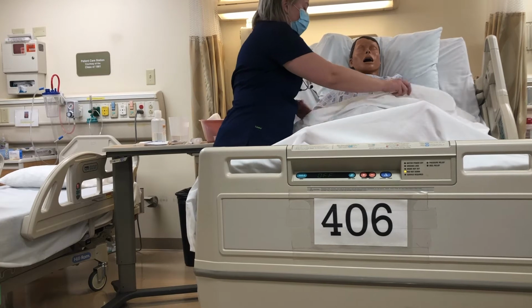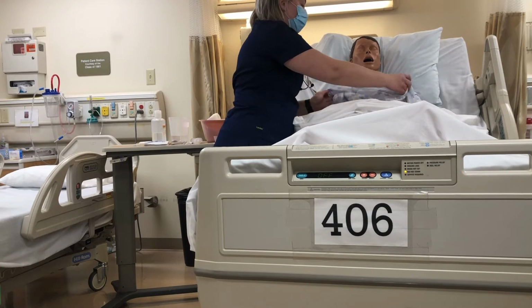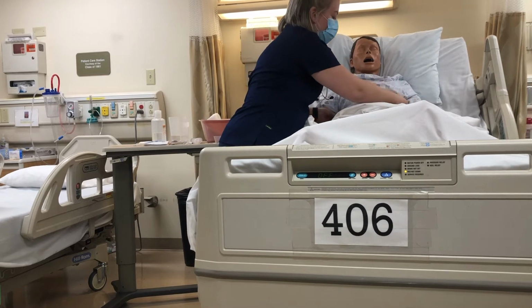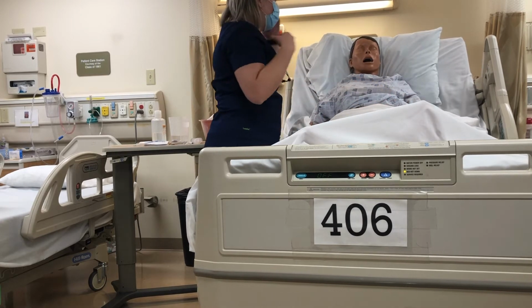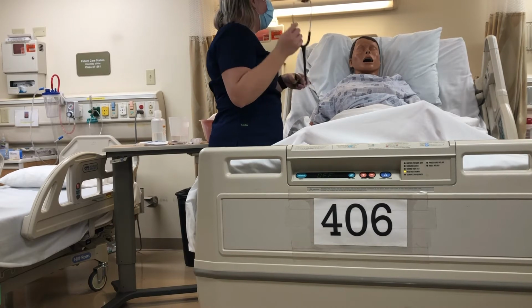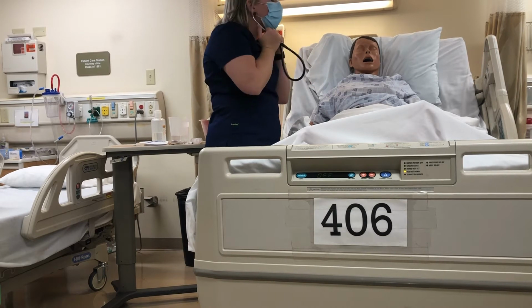Alright, and while we're waiting for that to kind of warm up, I'm going to start listening to your bowel sounds, okay? Alright, now this might take a few minutes, but just hang in there, breathe as you would normally, and we'll go from there.